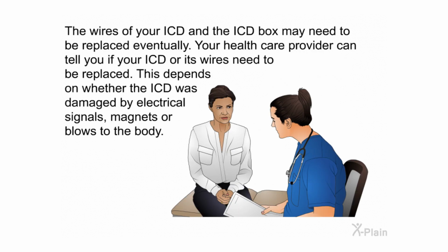The wires of your ICD and the ICD box may need to be replaced eventually. Your healthcare provider can tell you if your ICD or its wires need to be replaced. This depends on whether the ICD was damaged by electrical signals, magnets, or blows to the body.